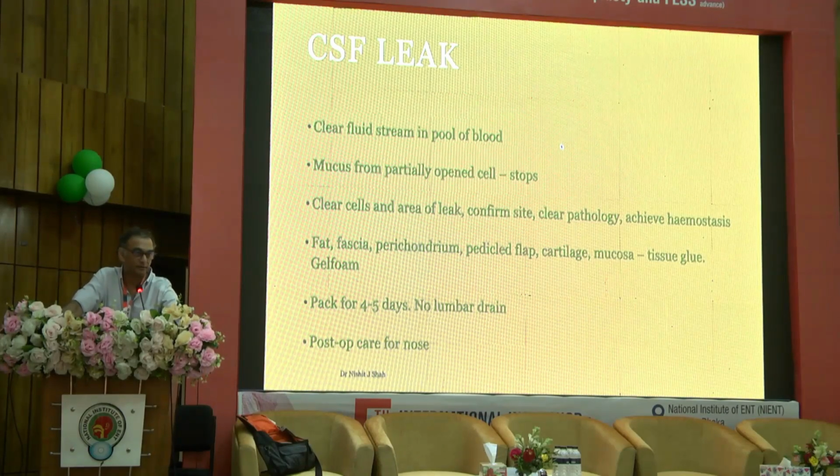This is the best time to do that. If you want to run away from the CSF leak at the time of surgery, there is a possibility it will heal because it's a traumatic leak. But if it doesn't, and you come back 5 days later, 6 days later, because now the patient's packs are out and he's leaking, and you go back, there's a lot of edema, there's a lot of crusting, and it's very difficult now to locate and repair this leak.